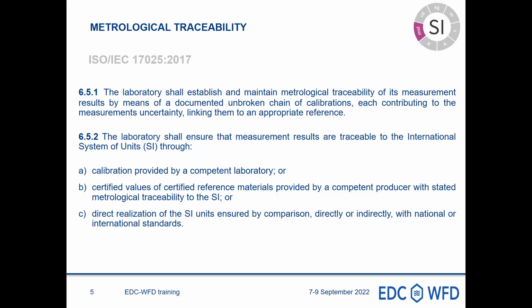Metrological traceability is also a key pillar of ISO 17025, and here we put the extract of this standard. First, the laboratory shall establish and maintain metrological traceability of its measurement results by means of a documented unbroken chain of calibrations, each contributing to the measurement uncertainty, linking them to an appropriate reference. So this is really the pure and intrinsic definition of what metrological traceability is.